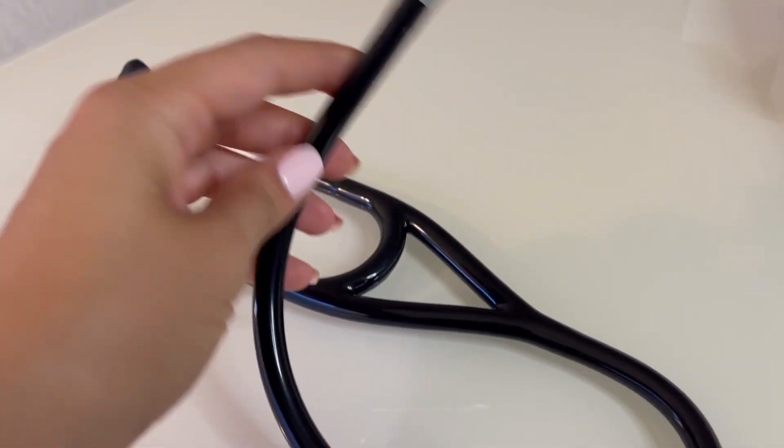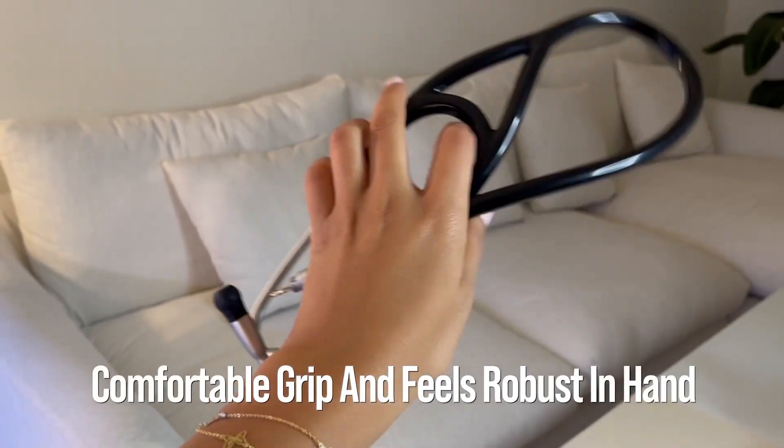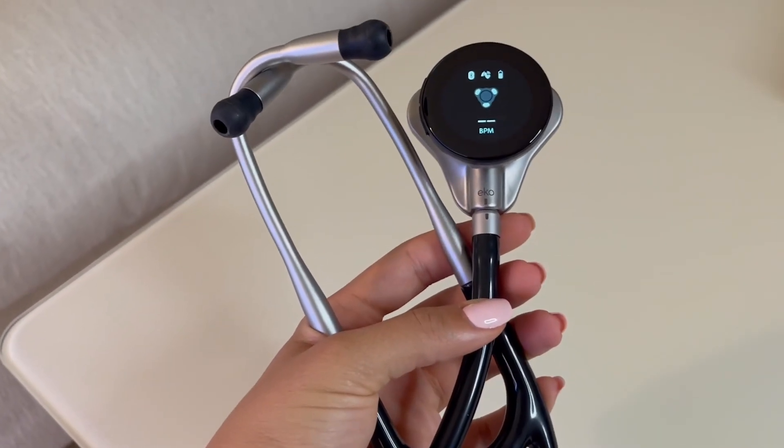The Echocore 500 is sleek, lightweight, and ergonomically designed. It has a comfortable grip and feels robust in hand. The chest piece is made of stainless steel and looks quite durable.